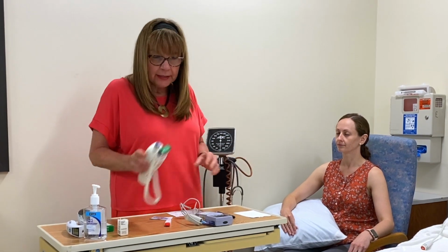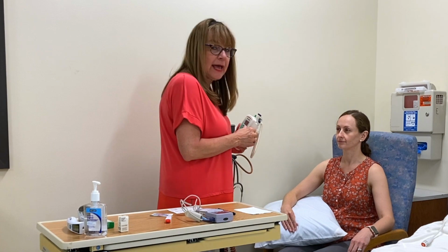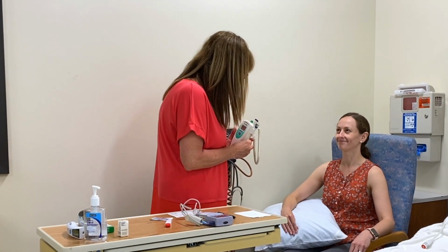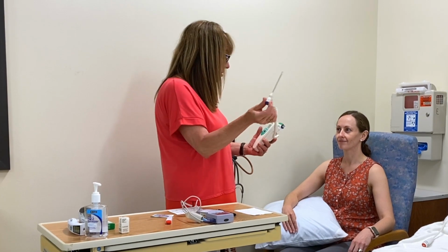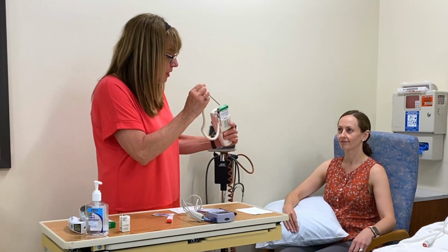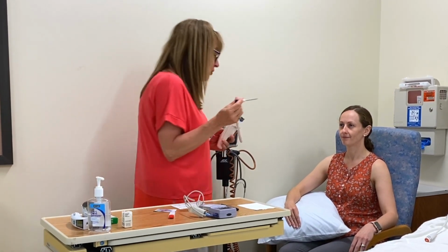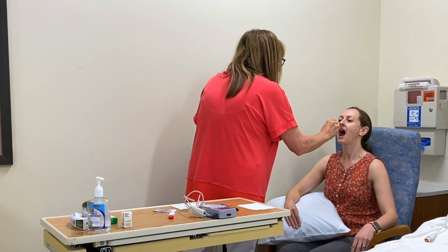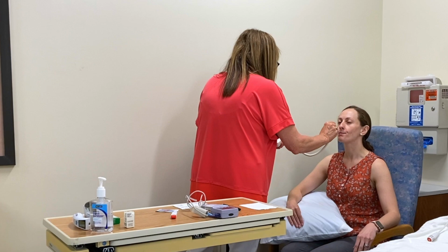So there are many mechanisms to take temperature. Now, Monique hasn't had anything hot or cold to drink and hasn't been exercising. She's been sitting here resting. Again, what we're going to do is these electronic oral thermometers all have a clear protective cap. And you're going to place this under the tongue on the side and hold it for the patient because it is very heavy.